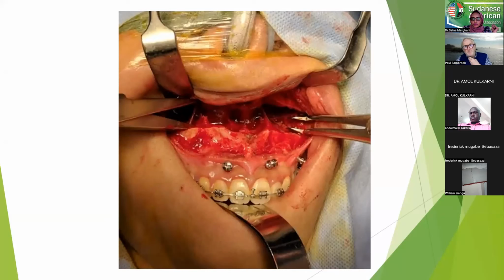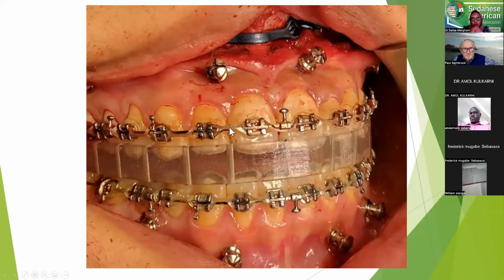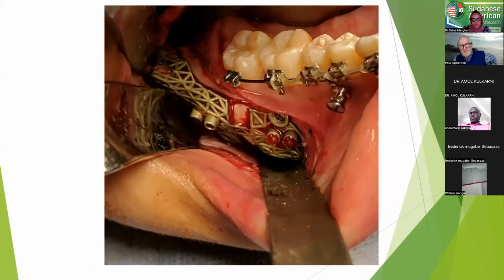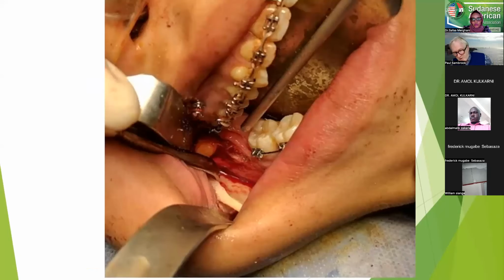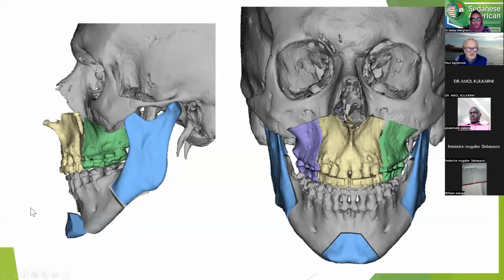And then placement of the final splint. And we checked this as I said, and then the mandible was cut likewise to the guide that was there. And again, looking at the movements that were performed here.